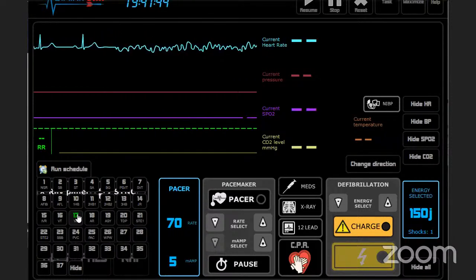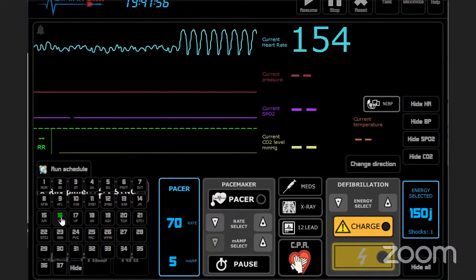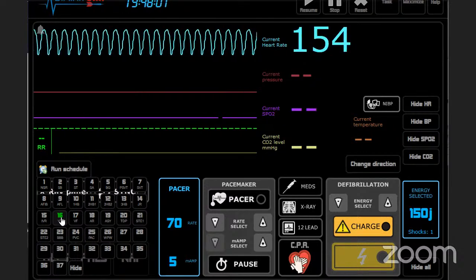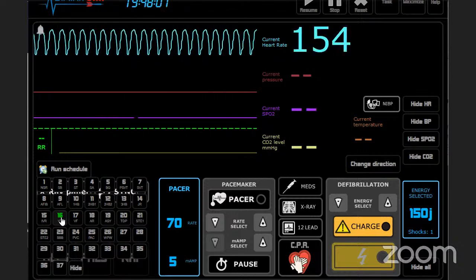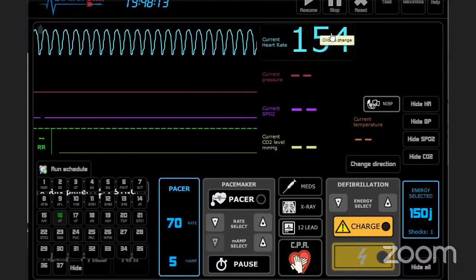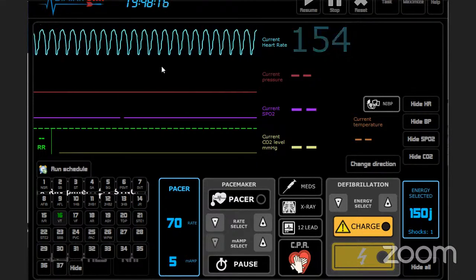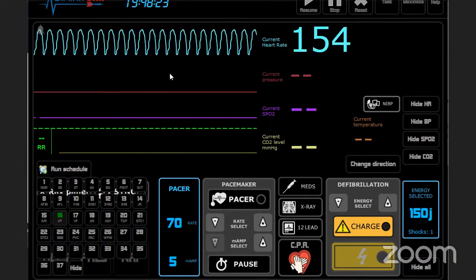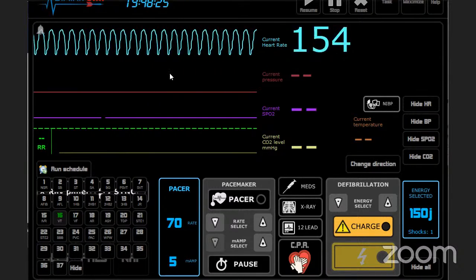So again, if you see ventricular fibrillation on the NCLEX, so this is your ventricular fibrillation again. We said there are two shockable rhythms. One of them would be your ventricular fibrillation, and the second one would be your, okay, so let me try and put it up here. So this would be the second shockable rhythm, which we refer to as a pulseless ventricular tachycardia. So it has a pulse. Again, this is a ventricular tachycardia actually, but if the patient presents with this and he doesn't have a pulse, so please just ignore the pulse that's showing here. Just focus on the rhythm. If the patient presents with a ventricular tachycardia and he did not have a pulse, this is automatically a pulseless ventricular tachycardia, and it's a shockable rhythm.